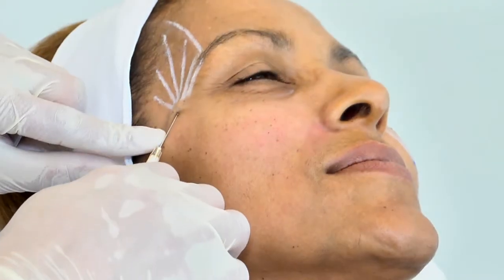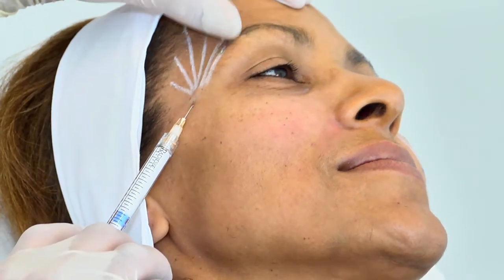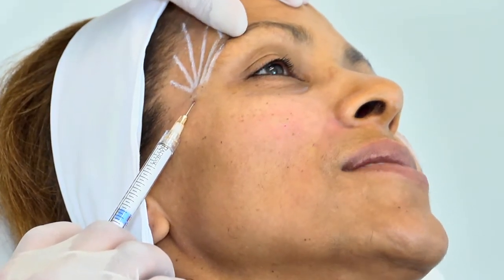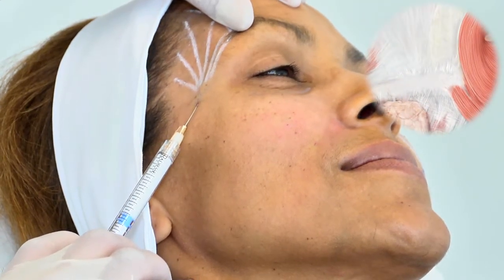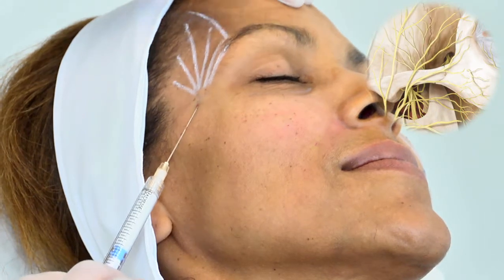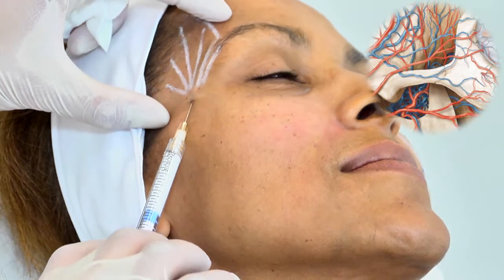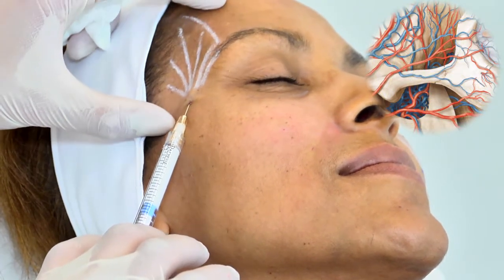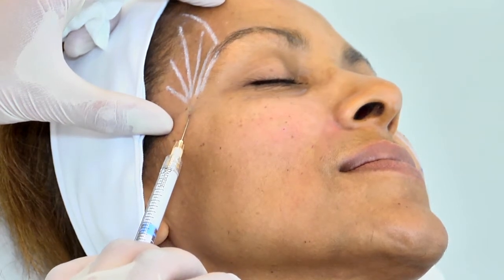Create a fan covering the entire area to be injected, which can then extend beyond the tail of the eyebrow. Note that skin is very thin in this area and the cannula should be inserted very slowly. Do not deposit Radiesse beyond the orbital edge. Sometimes it is necessary to complete the treatment with a bolus in the temporal fossa by very slowly inserting a needle perpendicularly to the bone and injecting a bolus in the supraperiosteum.